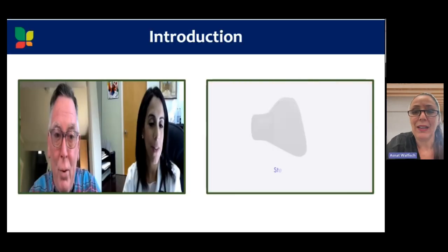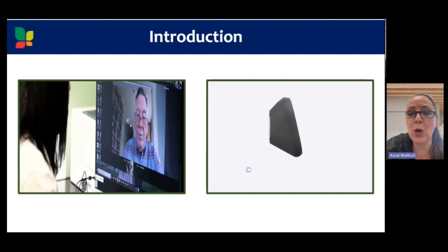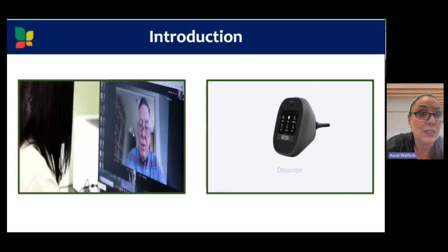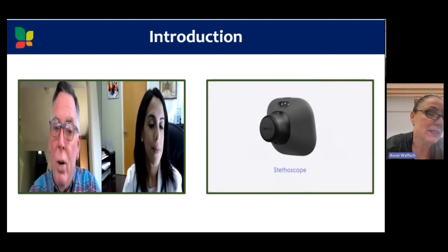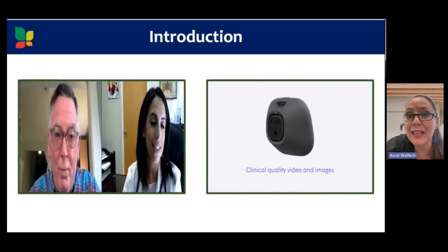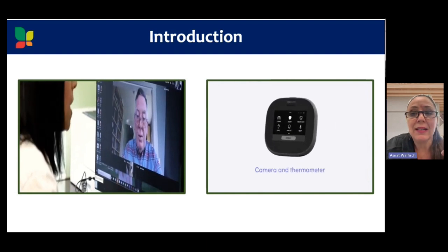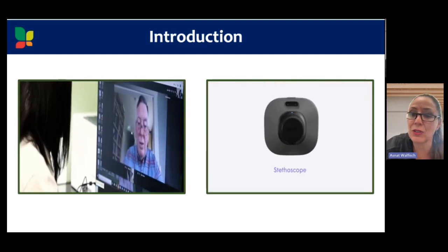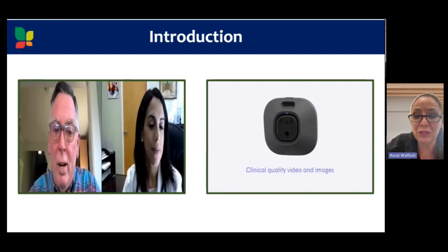So, the future is already here. Telemedicine already has many faces for remote, online, mobile, and real-time clinical care solutions. Here are just two examples from our day-to-day lives. On the left side, you see the routine, well-known, simple phone video medical consultation. We have that all the time. On the right side, you see a more high-tech solution, the Taito, which is a well-established service here at Clalit Health Medical Insurance, and it allows a self-made physical examination performed at home by the patient, inspection, auscultation, thermometer, and all of this is being shared online, real time, with a remote physician.